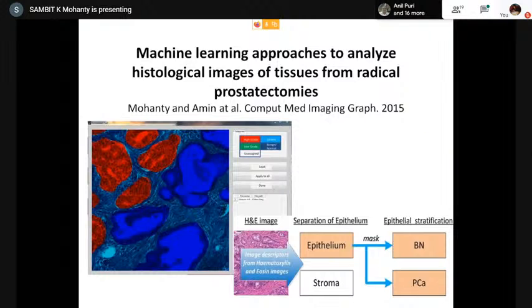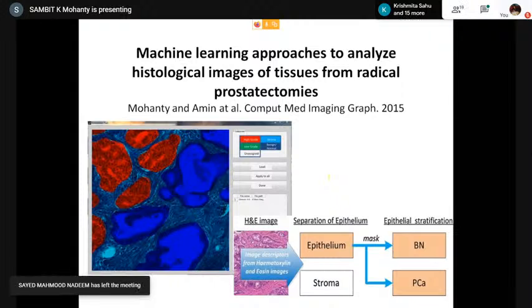So the blue one is stroma, red is high grade, that means 4 tumor, green is low grade. After we divide that, we can specifically say by the machine how much is 4 and 3, which is not always possible. This looks good in publication and not in real life. You can probably do it for 1 or 2 cases like that, but it is not a regular routine practice. You have 12 or 13 prostate biopsies to sign out in a day. You cannot afford to do this.